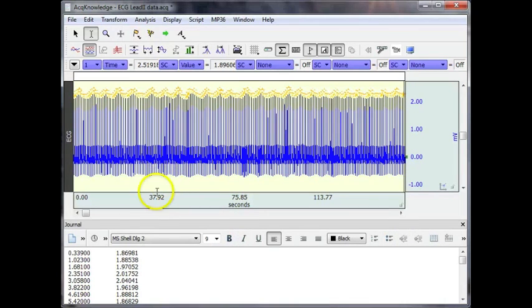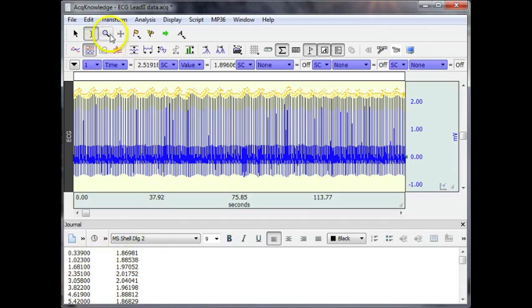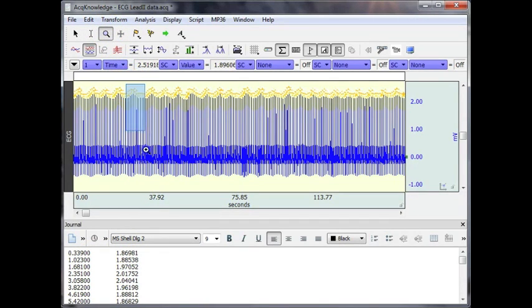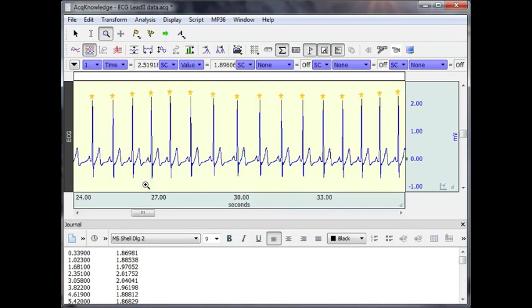So now, not only have we pasted our measurements down into the journal file, but if we zoom in, we'll see a star at the peak of each of these ECG waveforms.